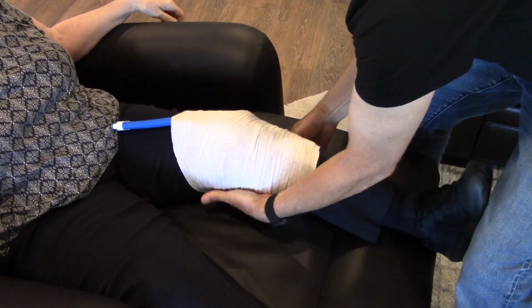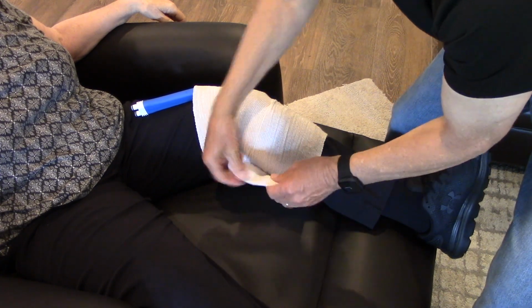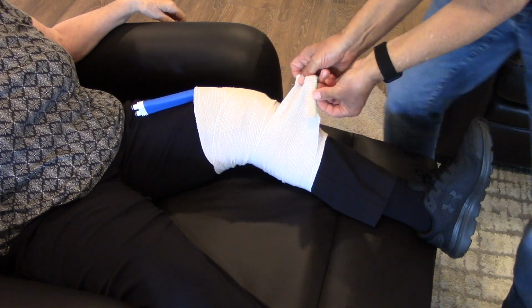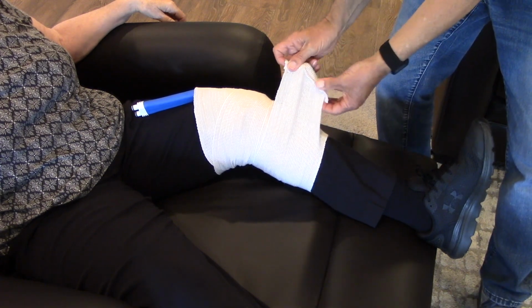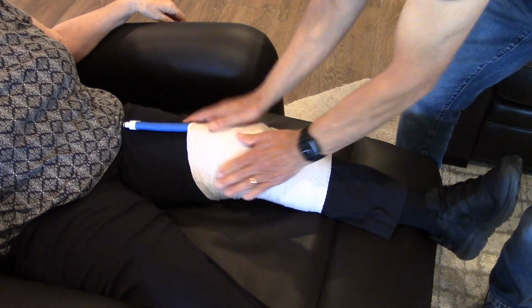And I'm trying to stay out of the bend right here because we don't want any constriction in there if we can help it. So come there. And this one has Velcro on the end, so I can just kind of go like that. You don't want to go super tight on here. You just want to have this so it holds in place.